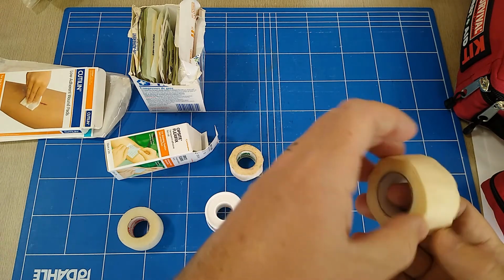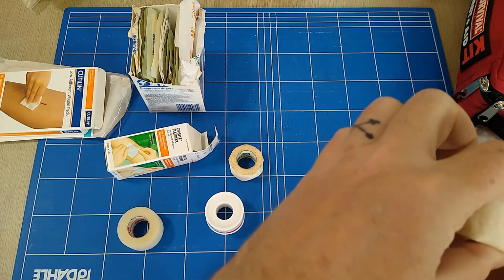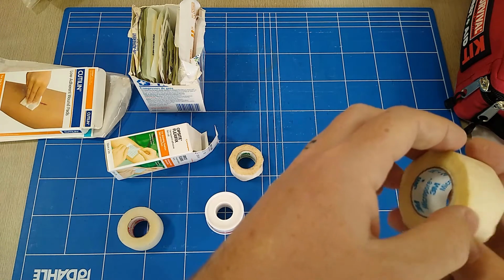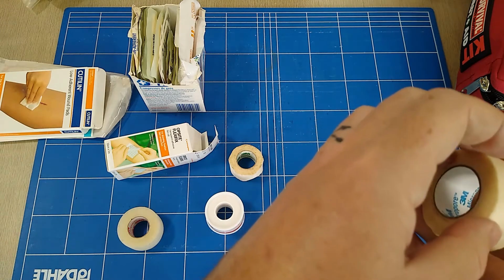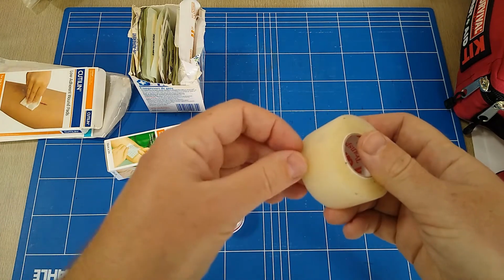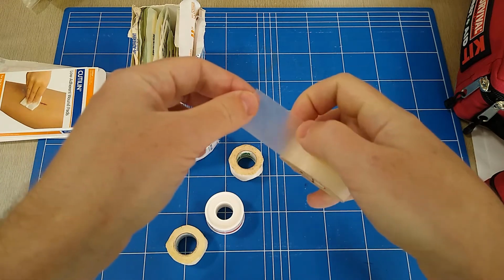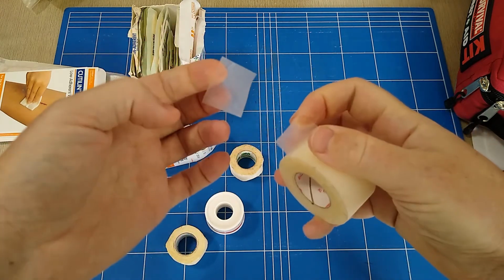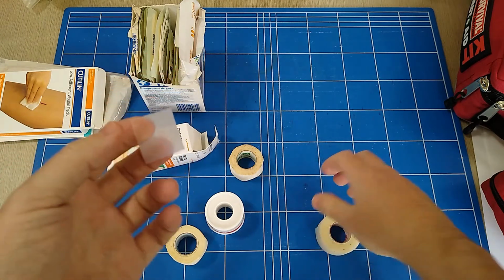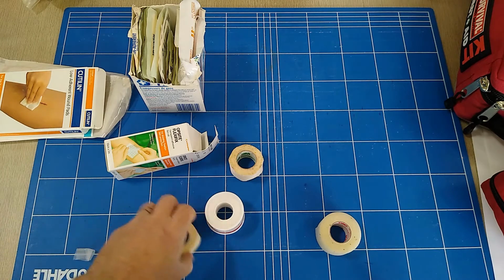And if you have a wound where you're actually going to want to open it up and clean it out more readily, or you're patching over something, then this is something that is going to be much more useful to you. I mean, this transpore stuff is clear plastic with literally a tear grid just stitched or punched right into it, okay? It sticks well enough, but it's only going to stick for a short-ish period of time.